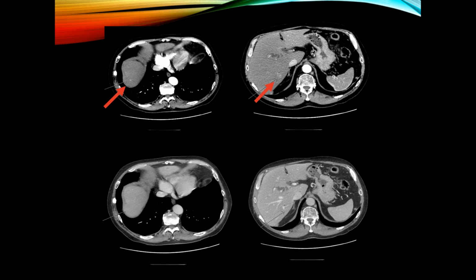So what we do is we first inject the IV contrast and scan the patient in 40 seconds, and then we scan them again a little later, probably another 40 seconds later, and this is called the portal venous phase. So a little later as the contrast goes through the blood system, and you can barely see that liver lesion anymore. So it's important to give IV contrast and to get the right timing of that contrast, or you can miss small lesions.